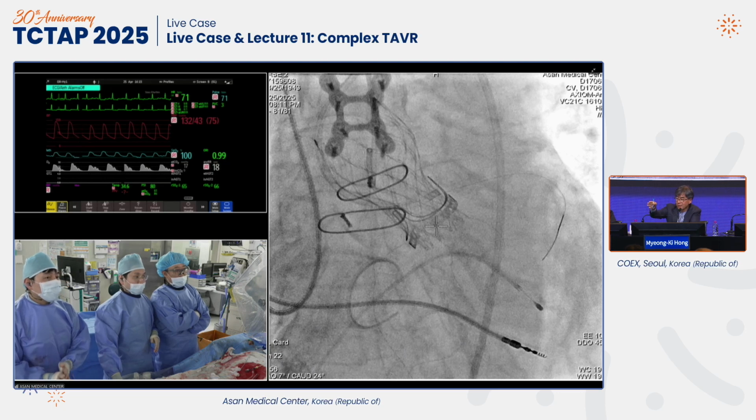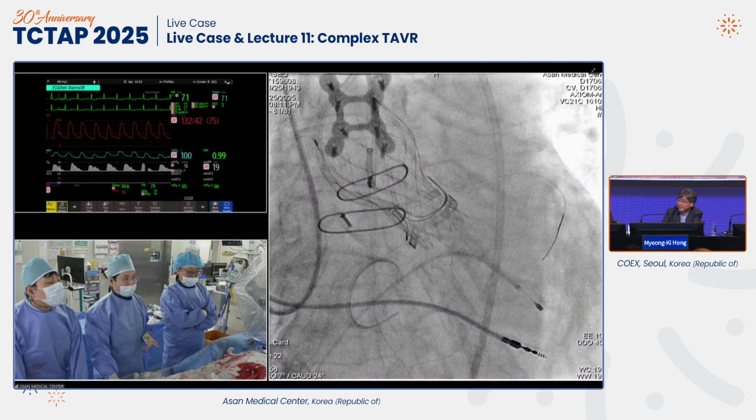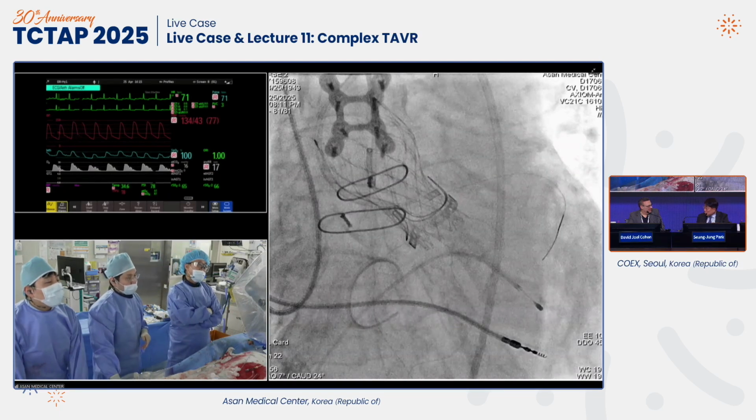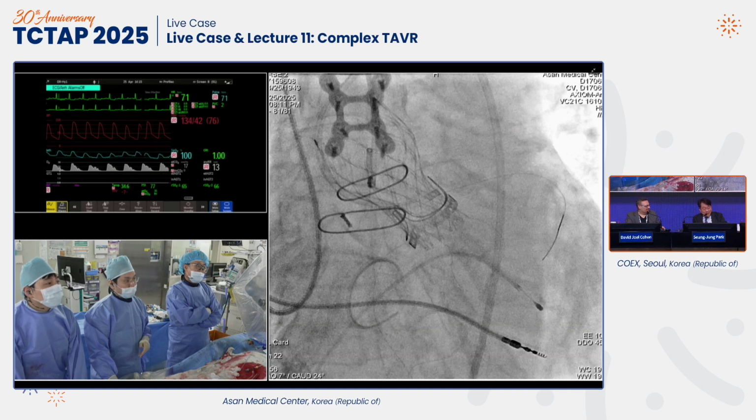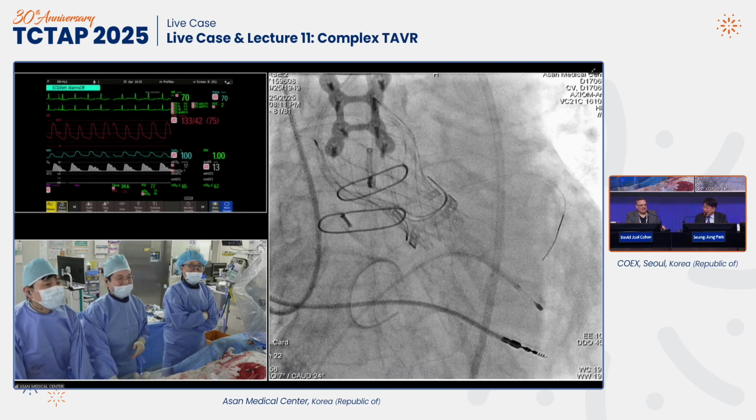Procedure-wise, it's very simple. Excellent. Yeah, well, I mean, Doug, you really make a complex table here. Absolutely. Alright. I'm very nervous. Alright. I have a nightmare with David Cohen. Wait a sec.